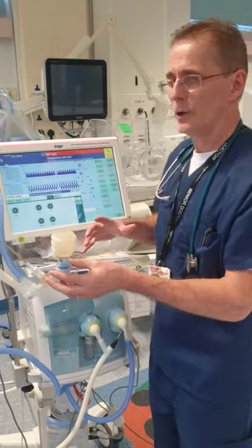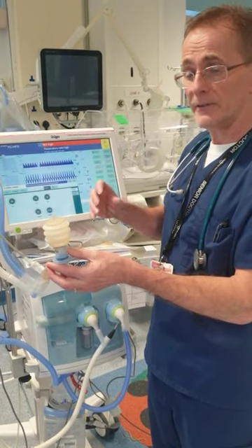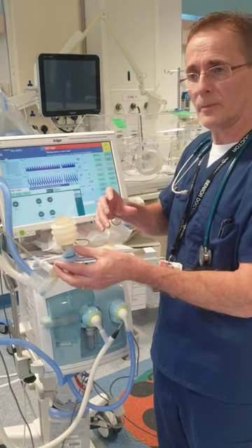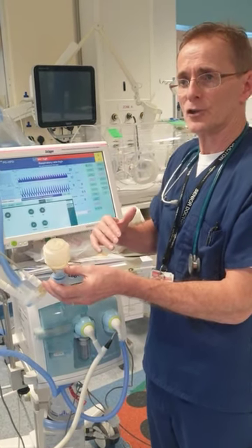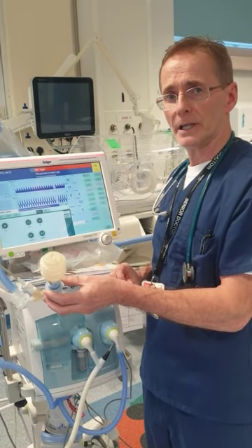And that's basically how we open up the lungs and then let them deflate again, but then reopen them and let them deflate to a level that is just above their closing pressure. And that's the ideal way of setting up oscillation for babies.